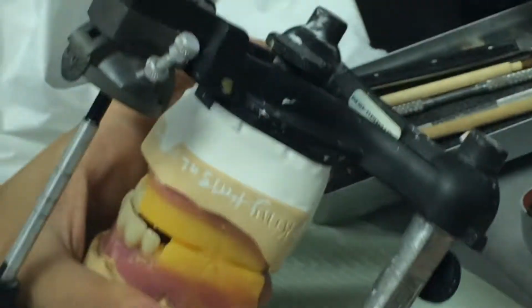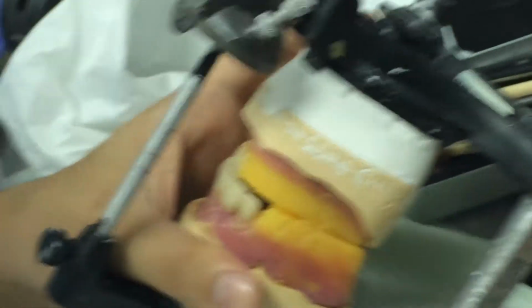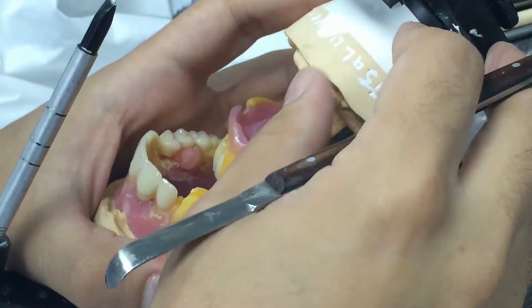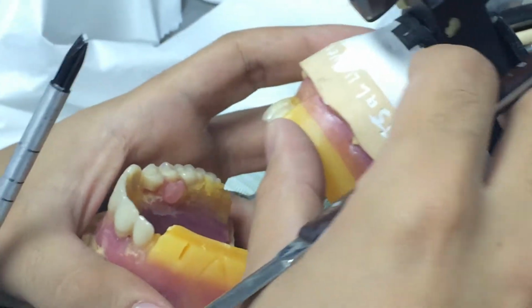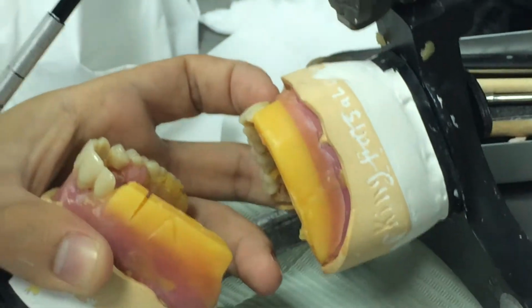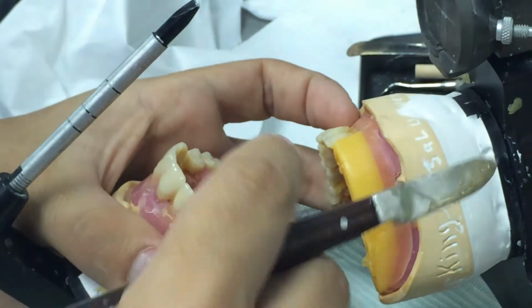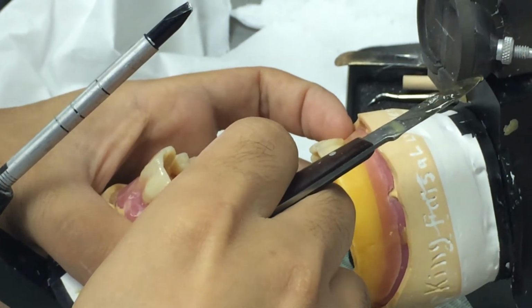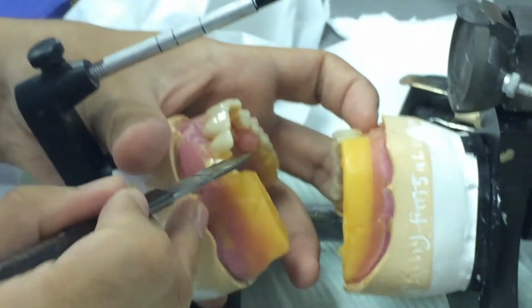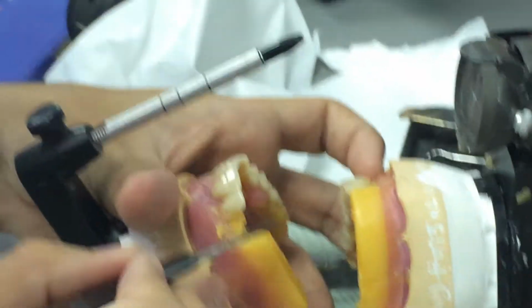الأول الميد لاين مع النوز. هذا if we are talking patient mouth ممكن gonna help you in the nose. لكن انت اليوم technician ما عنده نوز. So we're gonna find where the incisive papilla is, and then we're gonna draw the line going out.